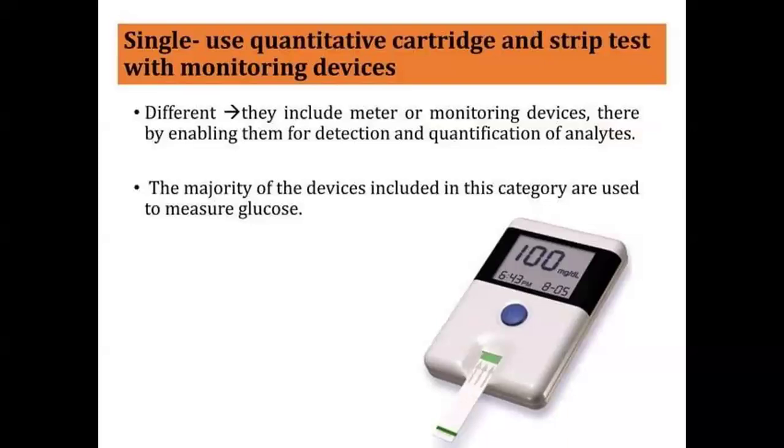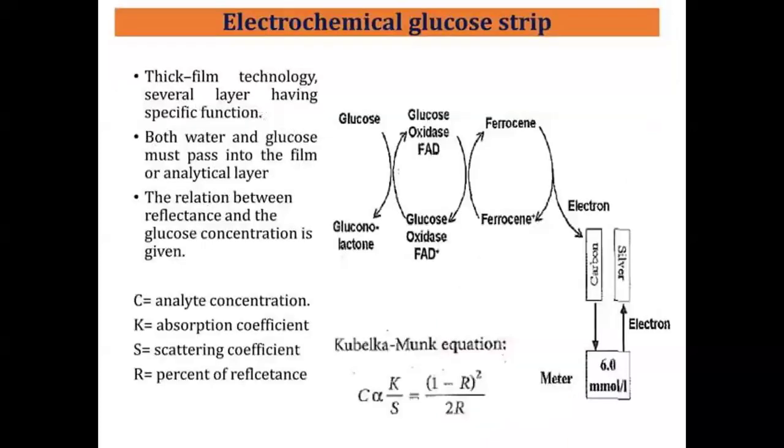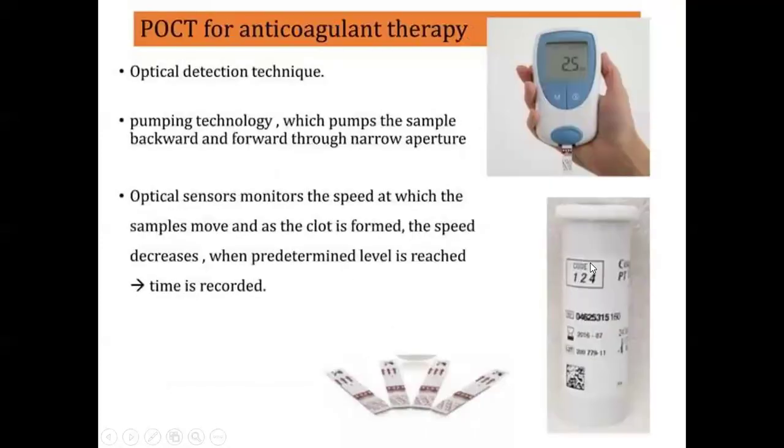So this basic example is a glucose sensor, which we have seen in most of the modules. This glucose sensor keeps repeating, and as you are aware, the enzyme used for sensing is glucose oxidase, and when glucose oxidase combines with glucose, the reaction will produce a drop in pH due to the negative ion production, which will be detected by the electrode present, which will detect the concentration of the glucose.